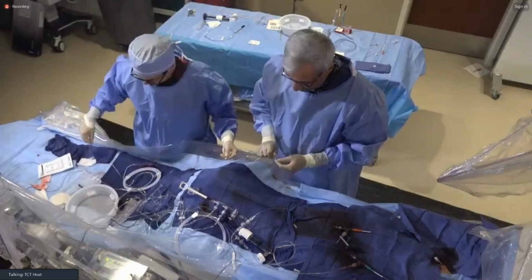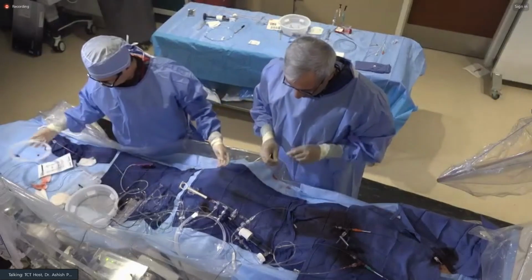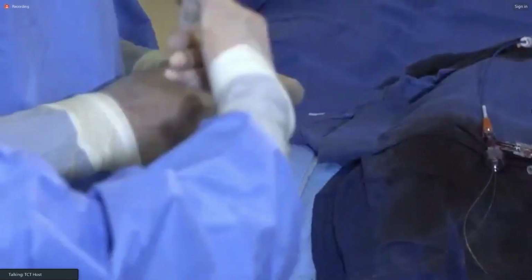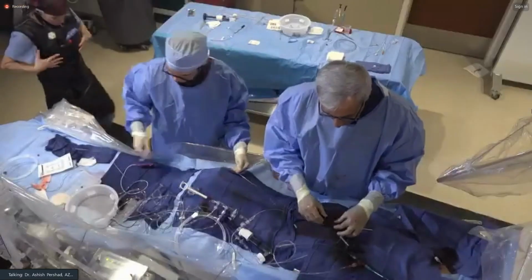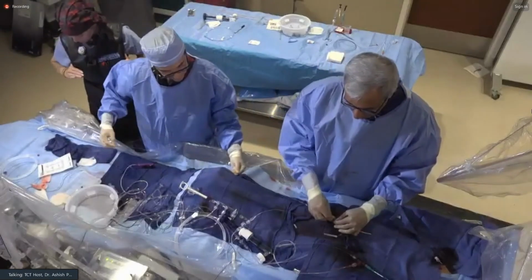Though tip loss is more common with the Caravel, the lower profile Corsair catheters, than with the Turnpikes because of the braiding that they have. Even so, Caravel is a particularly classic culprit for that.